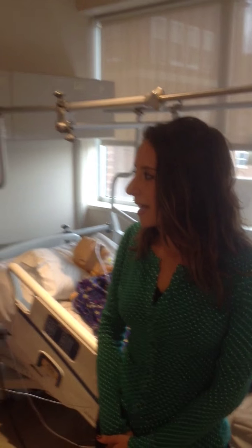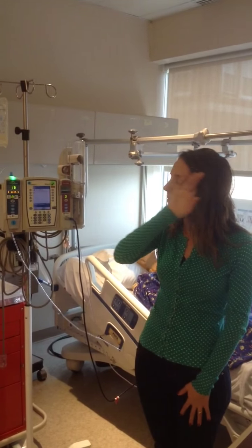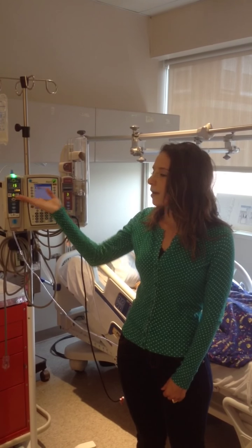So that's the lesson on how to use an Alaris PCA pump and how to manage medications using these pumps. For the next course, we'll be meeting on, I believe, Adobe Connect and discussing how Alaris has an interface now in which when you scan the medication and scan the patient, it will also be hooked up to the patient's EMR. This is exciting in that we won't need, as a nurse, to enter in any numbers, and there'll be less risk for error. So, to be continued.